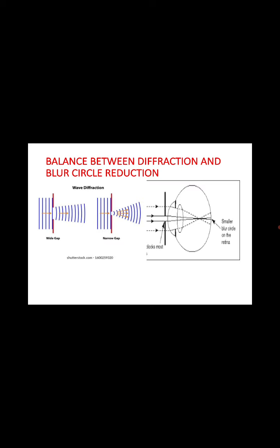Pinhole is not a magical thing. It works, but it is not perfect, because pinhole does not provide a perfect image because of diffraction. So we always tend to choose an ideal pinhole size of approximately 1.4 mm. There are different concepts, but clinically we never go below 1 mm, because below 1 mm there is huge diffraction and a reduction in the quality of the image.